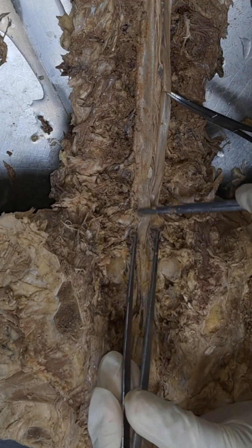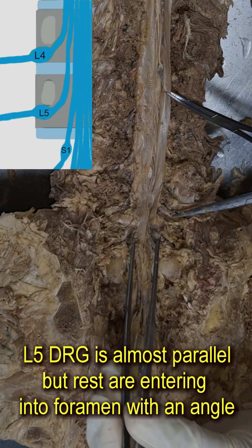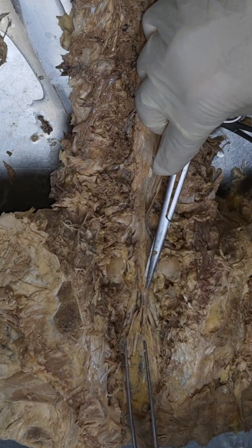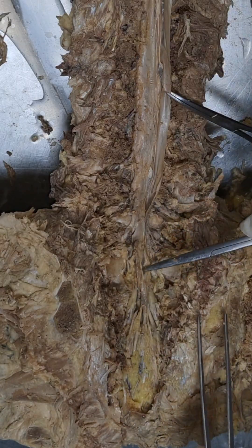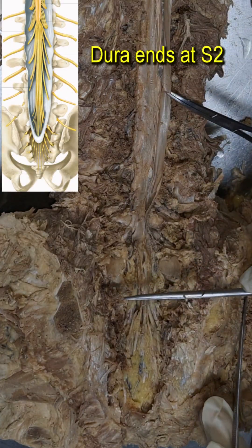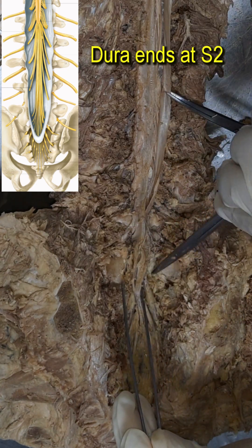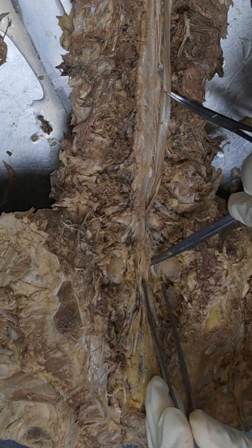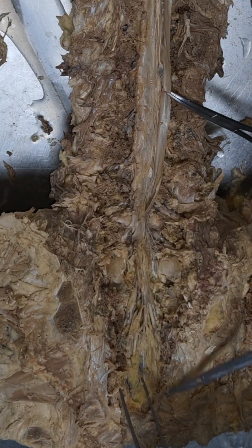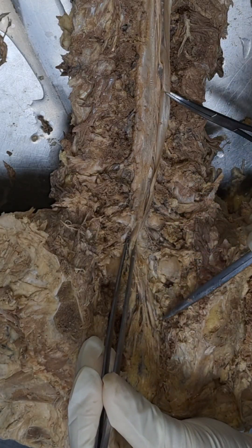This is L5 — see the angulation; L5 is almost parallel. Now coming to S1. See how the dura is ending there slowly. This is the level where the dura is ending. Now this is S1, this is S2, this is S3, and S4 is coming there. So: L5, S1, S2, S3, and S4.